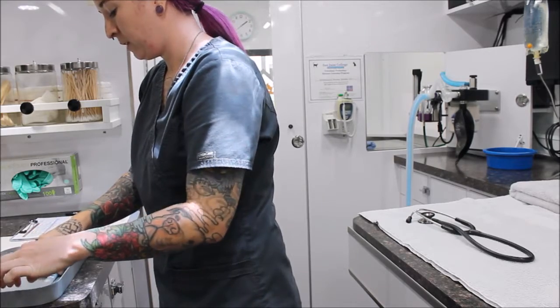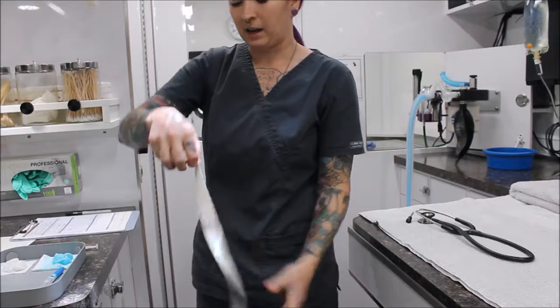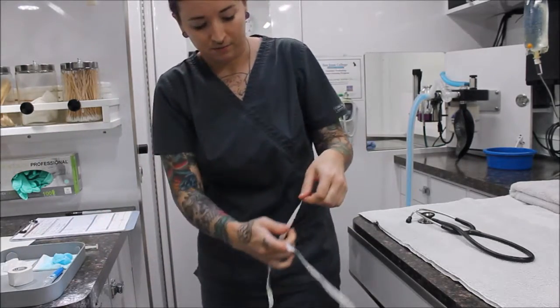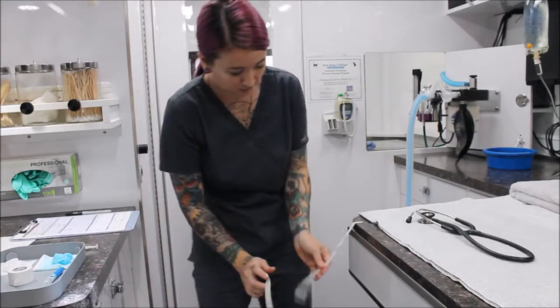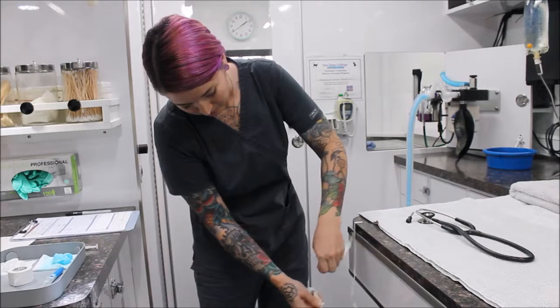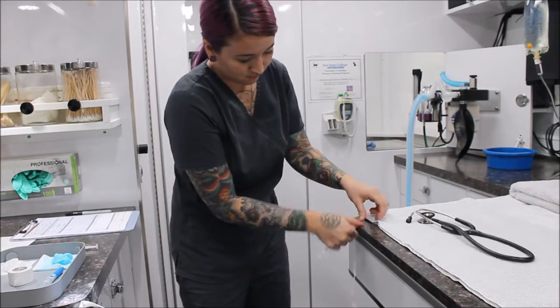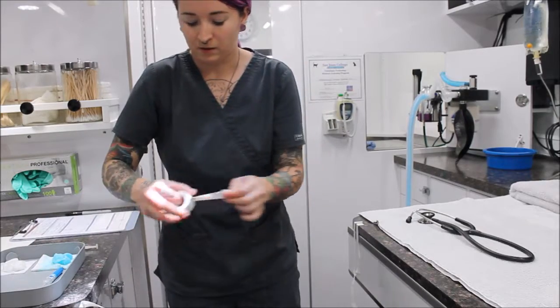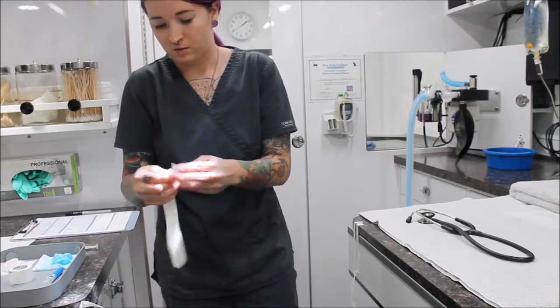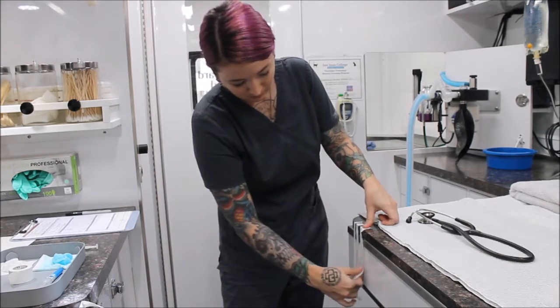So after we've done that, next thing I want to do is just go ahead and make sure that I have my tape ready for my patient. So we're just going to go ahead and tape it right here, because this is the area that we'll be placing our catheter in. I like to get one more strip here. Little notch in it for extra security.